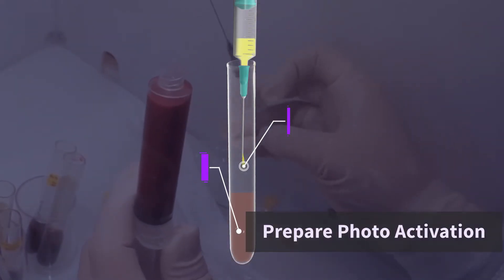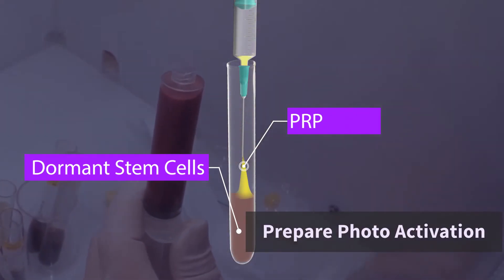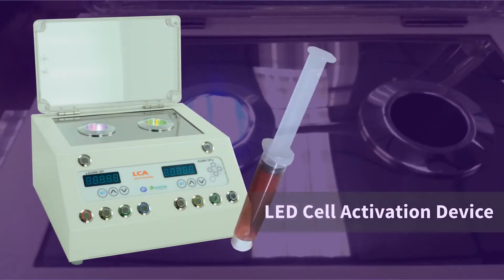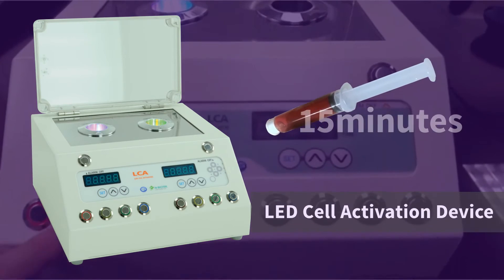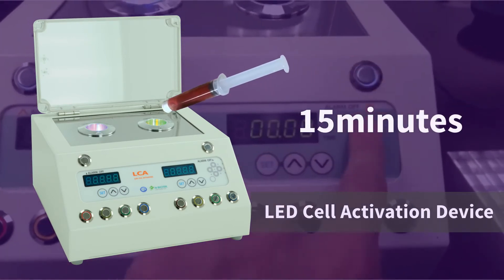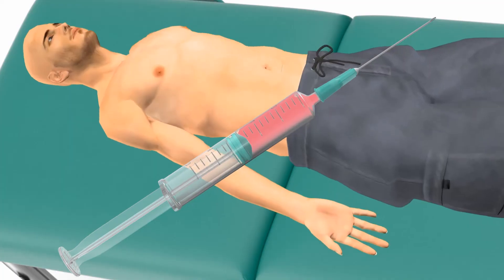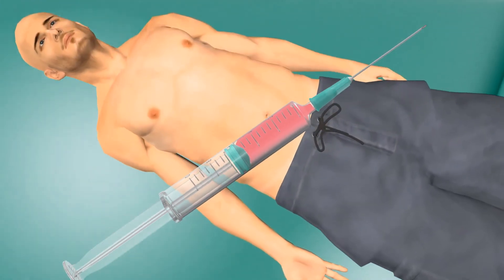The yellow PRP is removed and added to the patient's dormant stem cells. This solution is now ready for photoactivation using the LED cell activation device. Photoactivation of the patient's stem cells takes 15 minutes. The patient's activated stem cells are then placed into a syringe.